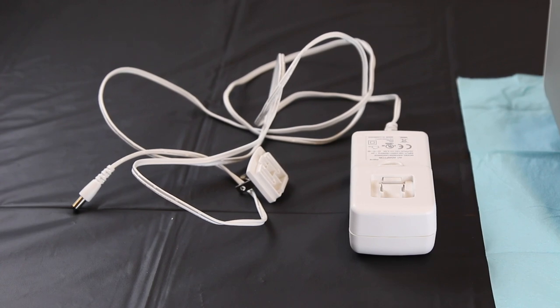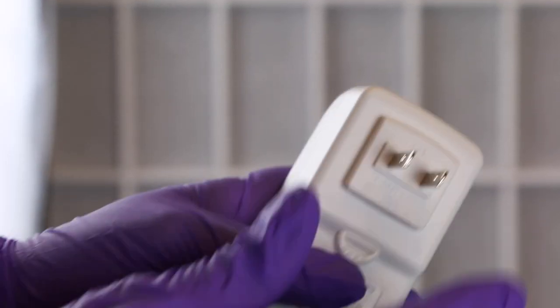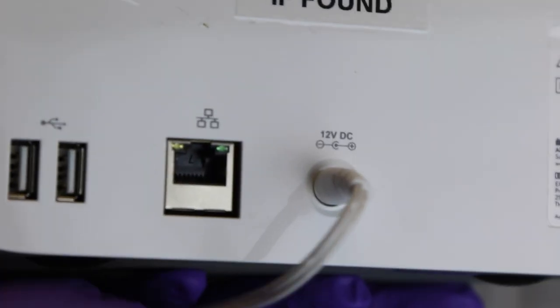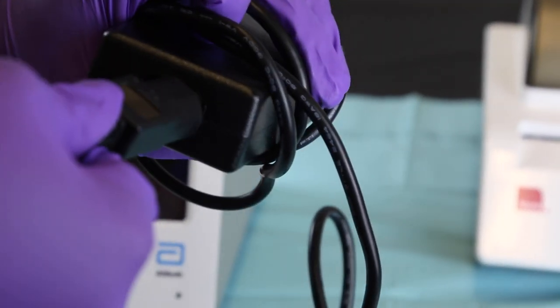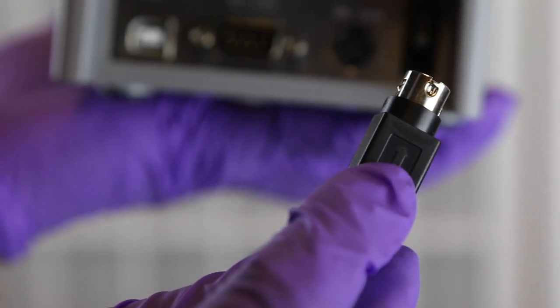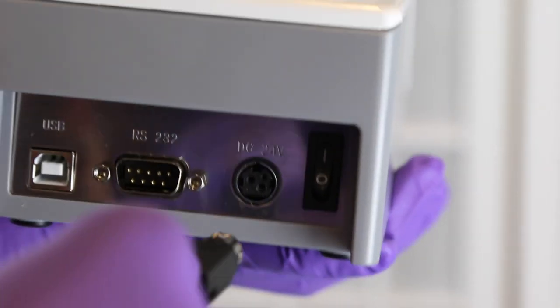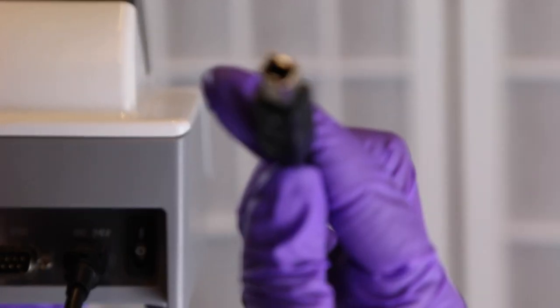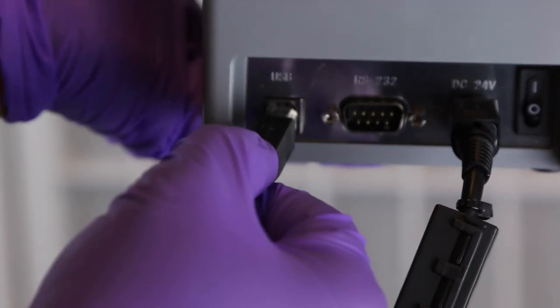Begin by connecting the proper adapter to the power supply for your country's power outlets, then connect the power supply to the Abbott IDNOW. The power supply for the printer comes in two parts — connect the two parts and plug them into the printer and wall outlet. The third cable that comes with the printer is a USB connection cable; connect the printer to the IDNOW as shown.